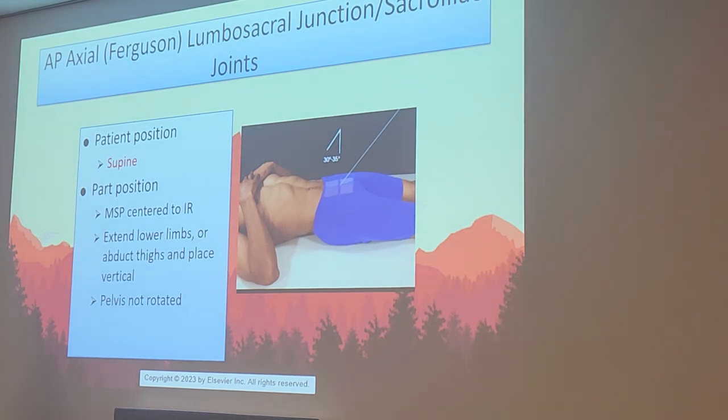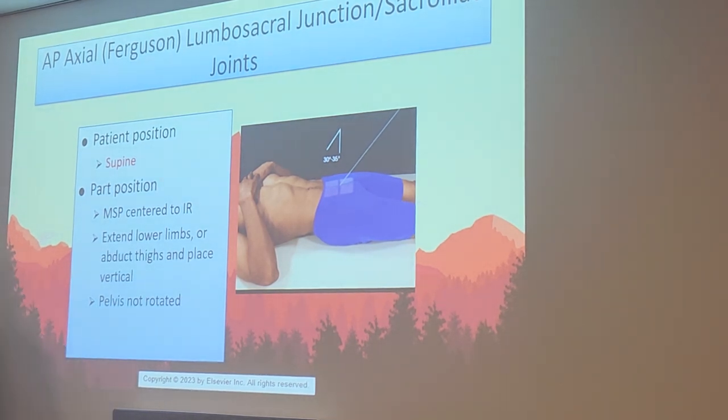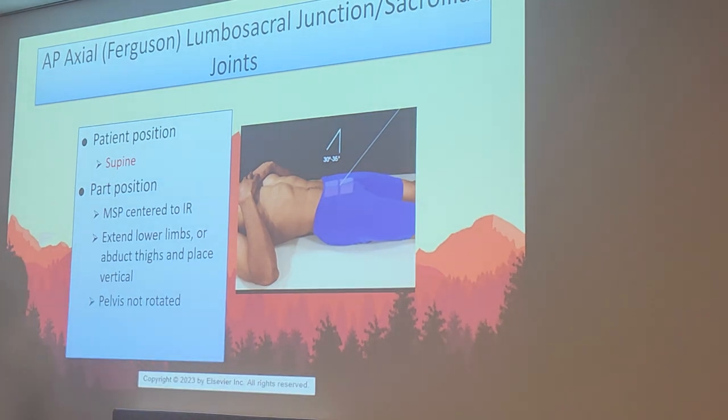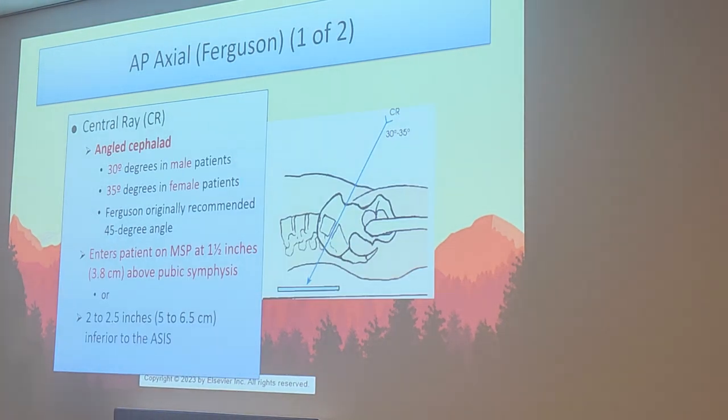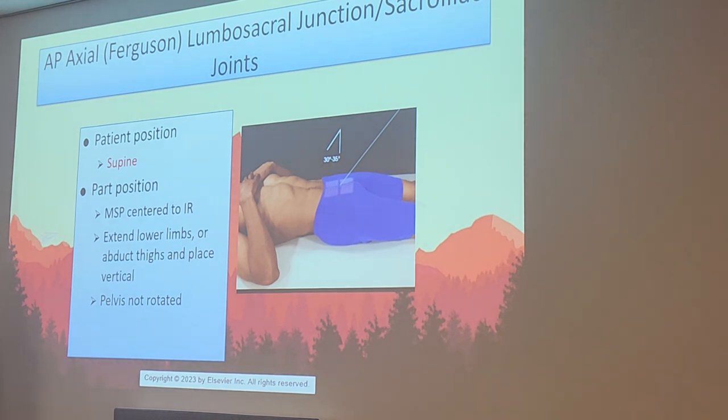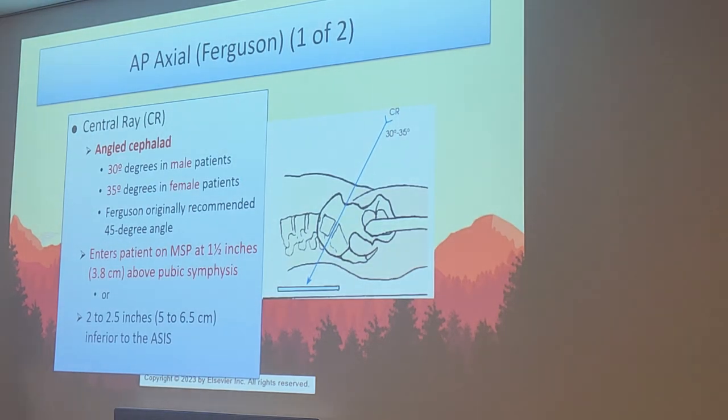30 to 35 degree cephalic angle, specific. Kind of looks like a sacrum X-ray, right? Very similar. All right, so there are slight variances. You see there's a range, and there's a reason for that. It's because between male and female, we have to make slight adjustments. So no matter what, it is a cephalic angle. But for males, we're going to use 30. For females, we're going to use 35. That's because of those different pelvis shapes that we learned back in Rad Pro 2.